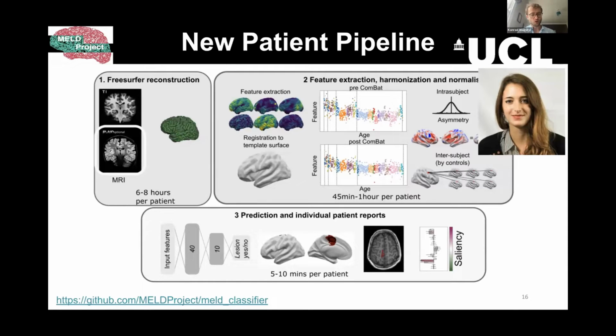So I would say you don't want strong motion artifacts because they won't necessarily be things about your scanner. They tell you more about that the person moved in the scanner. But in terms of patients versus controls, either is fine because FCDs tend to move around, so you're not going to get a systematic bias. I mean, if you have 20 controls, that's absolutely the best, but if you have patients, that's also fine.